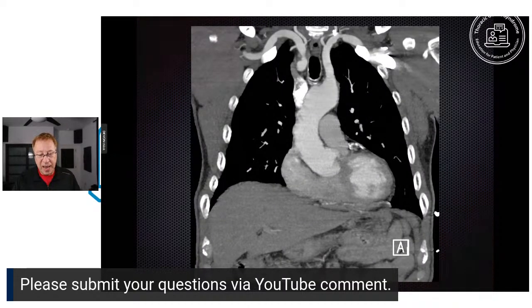So this is a CT angiogram. Remember we talked before about a direct angiogram or catheter angiogram. We actually have to puncture an artery and run a plastic catheter and then inject the dye. Well, this CT scan is done with a small cannula or small IV in the crook of your elbow. And you inject the dye, you watch where it flows, and at the right time, you do the CT scan. You'll notice right in the center that curved, bright white thing, that's the aorta coming out of the heart. That's the big artery in the heart. And you'll see two subclavian arteries up around the first rib at the top of the picture. You'll see next to those subclavian arteries the very bright white first rib.